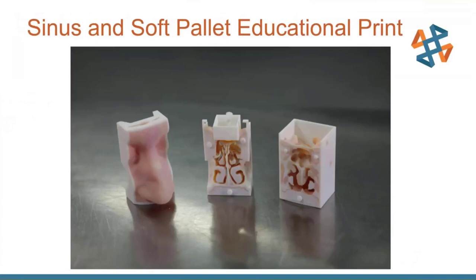Here we have some sinus and soft palate educational prints for training at a school. They're meant to show the sinus cavities around the eyes and the soft palate as an educational guide for surgeons, physicians, and ear, nose, and throat medicine. This is an assembly — the outside piece snaps to the back and then goes into a mannequin so somebody can practice the surgery on true patient anatomy.